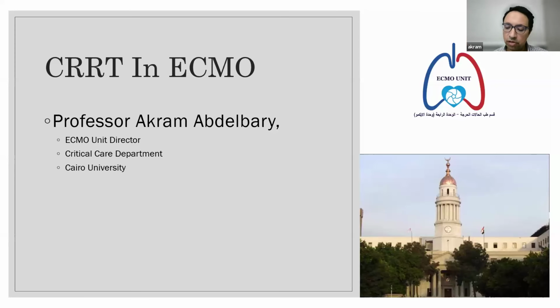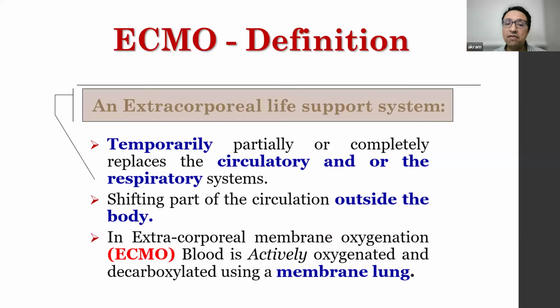Thank you, Dr. Yasser, for this invitation. I am talking about continuous renal replacement therapy in ECMO patients. First of all, I'll give you a brief about ECMO. What is ECMO? ECMO is one of the extracorporeal life support family of systems, which involves temporary support of the heart, the lungs, or both.